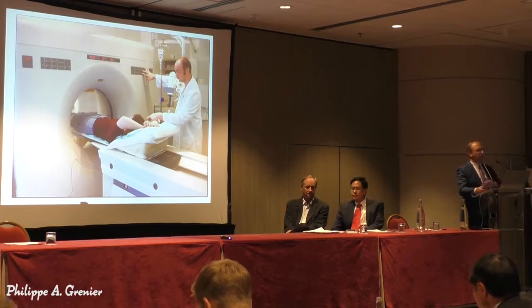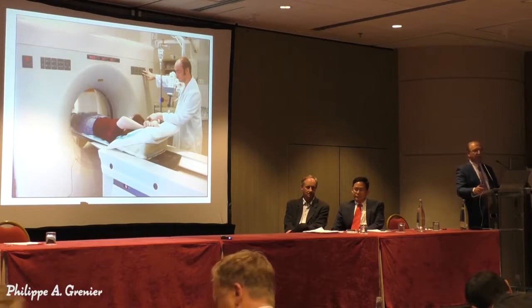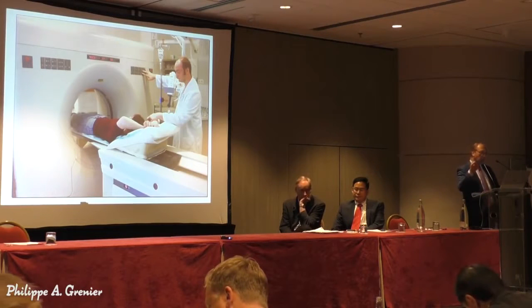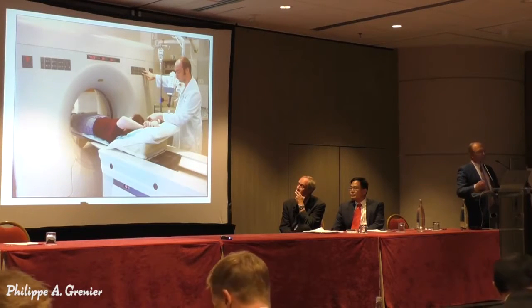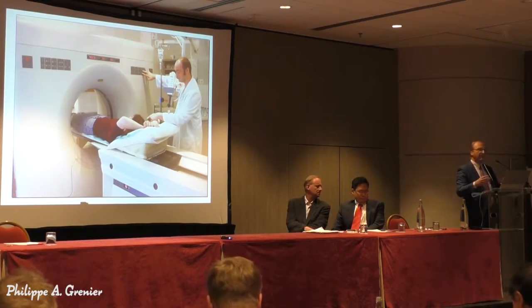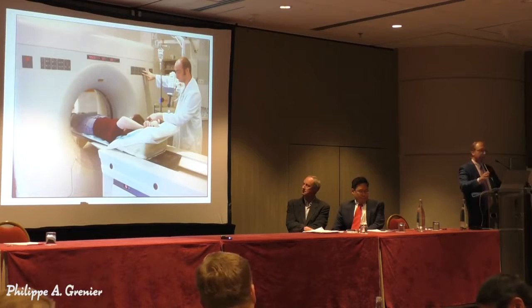Secondly, we have, of course, the perfusion in the vein of the arm to inject iodinated contrast material. It is injected as a bolus during the CT acquisition. That permits us to enhance the lumen of the vessels, making the difference between the vessels and the perivascular infiltration in this disease.